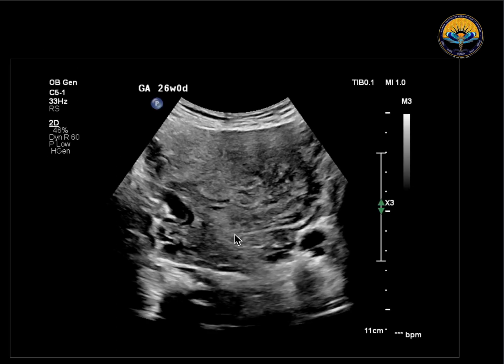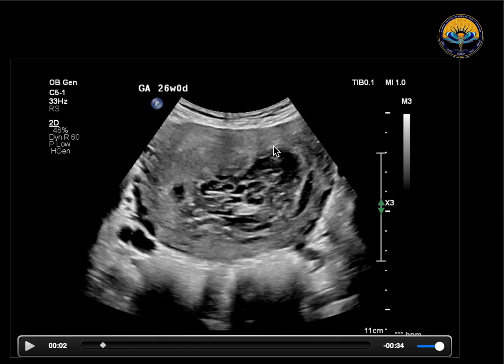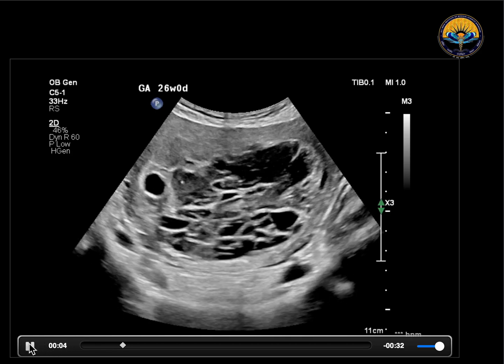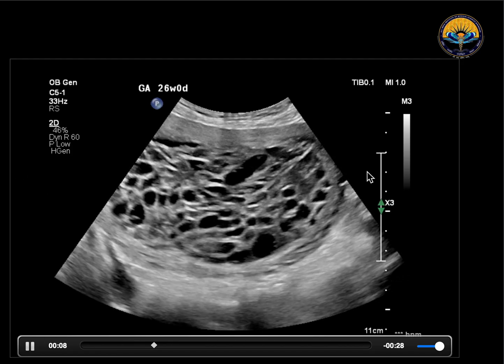As we began our scan, the first thing we could see was that the uterus was markedly enlarged in size. Further, as we started with the scan, we could see a heterogeneous mass within the endometrial cavity of the uterus. As we progressed with our scan, we could see this heterogeneously echogenic mass contains multiple cystic lesions of variable size within it.